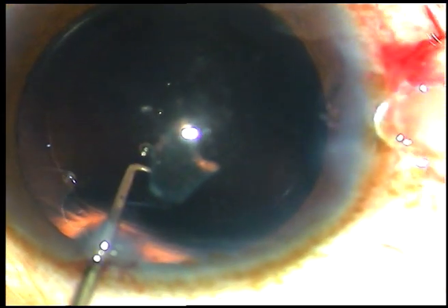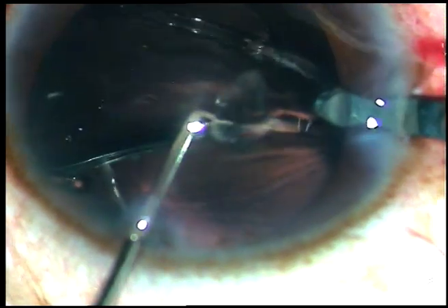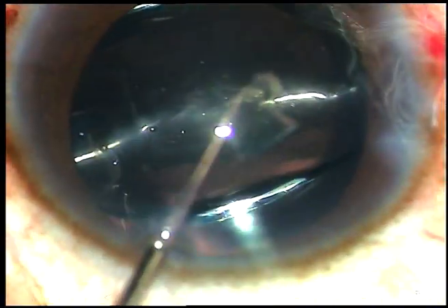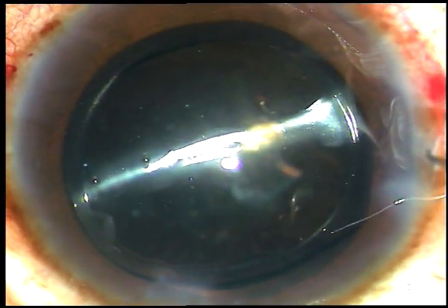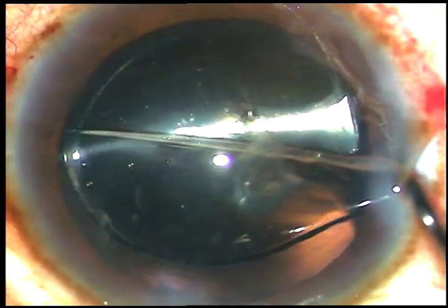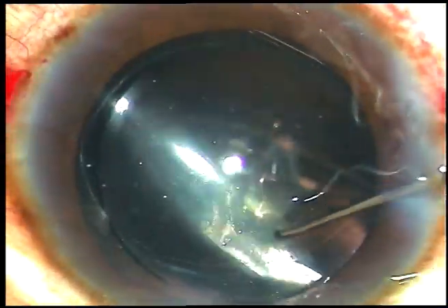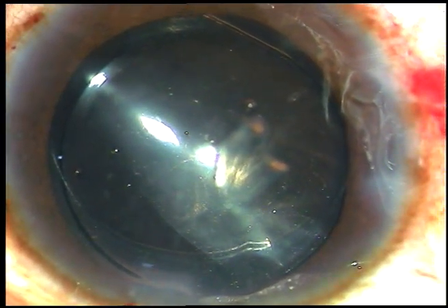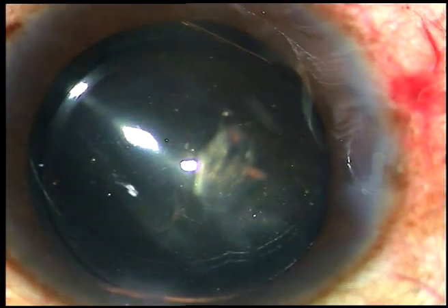Now here is the intraocular lens. The lens goes into the capsular bag. The left hand instrument helps the lens to settle in the capsular bag. A Sinski hook is taken and the lens is dialed in such a way that you can go behind the IOL to clean the capsular bag.